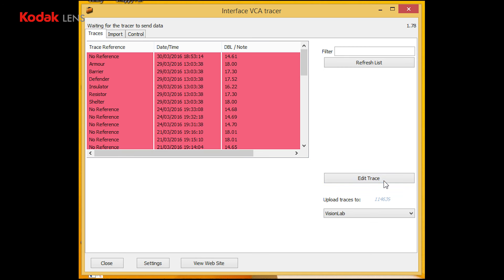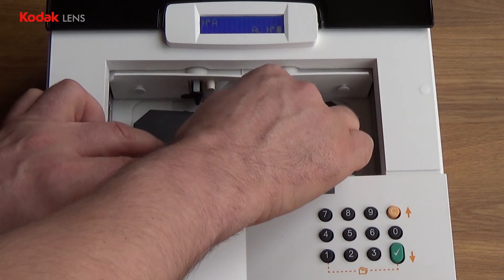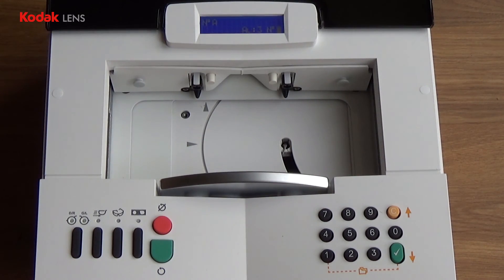Click OK and OK. Remove the calibration jig, and you are now ready to start tracing.